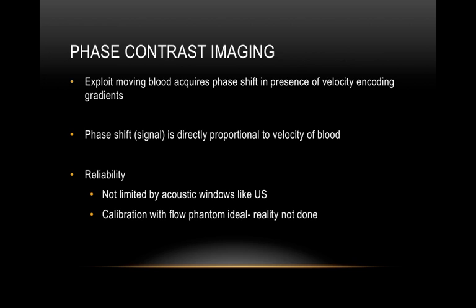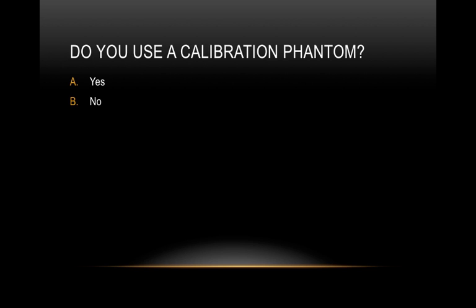Now, ideally, we would have a calibration using a flow phantom. However, this appears to be an issue of the past. In general, we don't have to worry about calibrations on the modern machines today. How many of you actually use a calibration phantom? If you do, answer yes. If you don't, answer no. I would suspect that it's a relative minority.